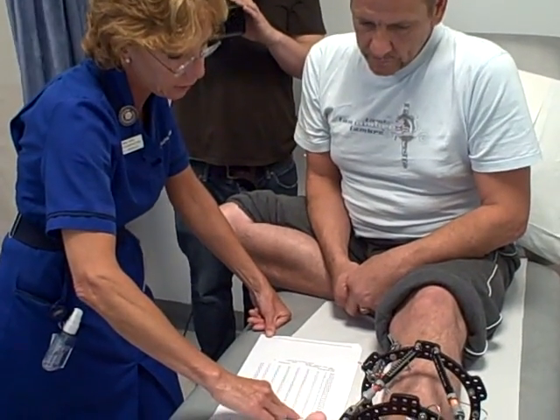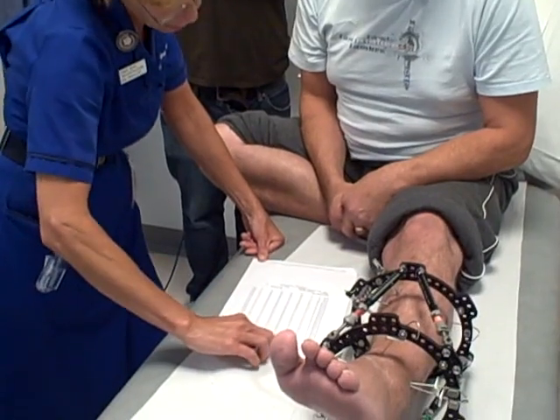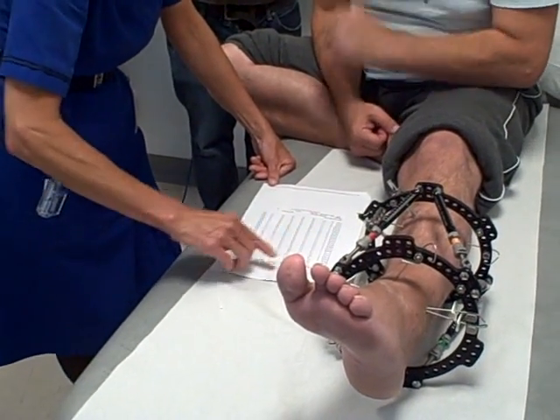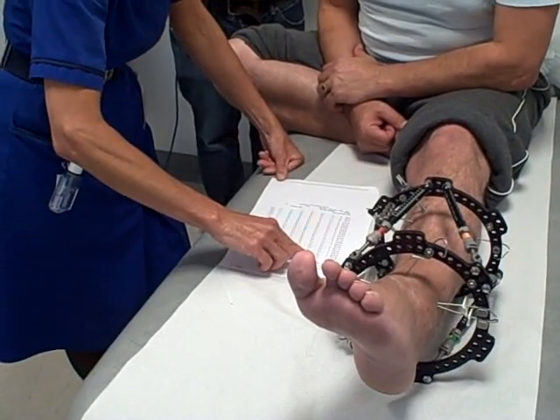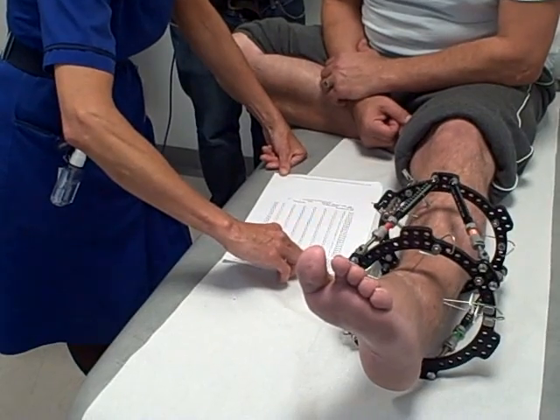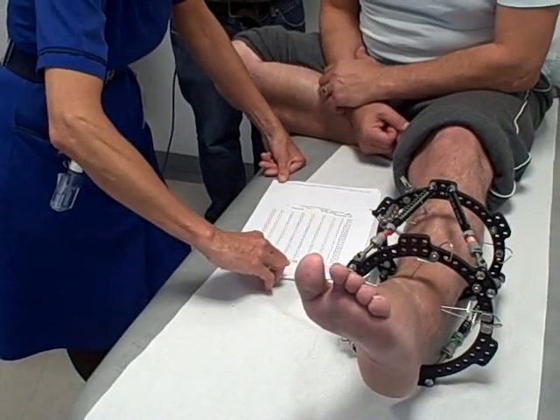So what you do for the first day is just check that strut number one is 175, number two is 175, and so on. The next day, number one is actually going to stay at 175, and number two is going to stay the same as well.